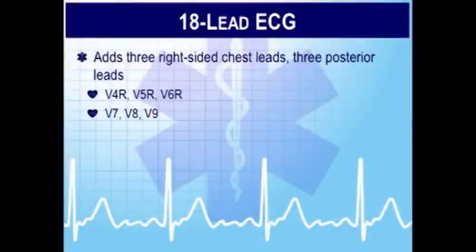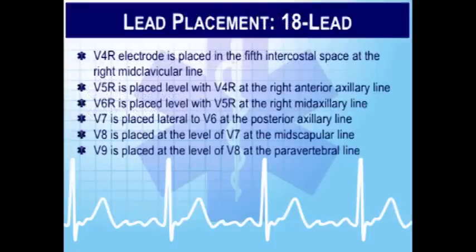How many of you have ever seen a 15 or an 18 lead ECG done? It is done. It's not done that commonly. It became sort of fashionable to do it for a while. I would say most patients are not having 15 and 18 lead ECGs done when they show up in an emergency room. Most.